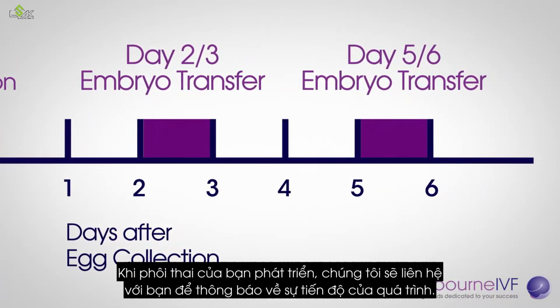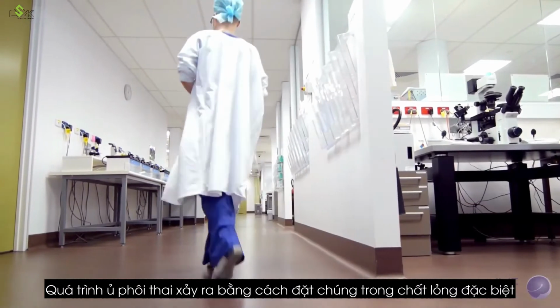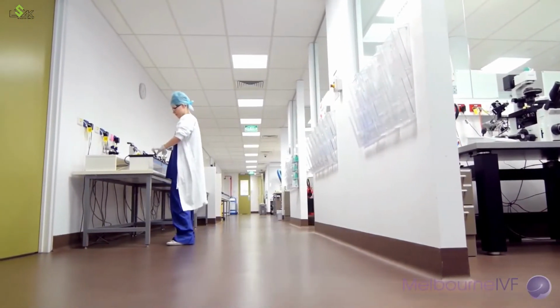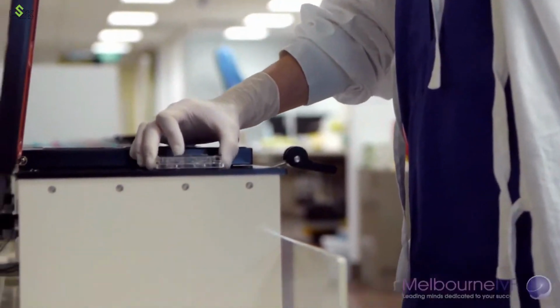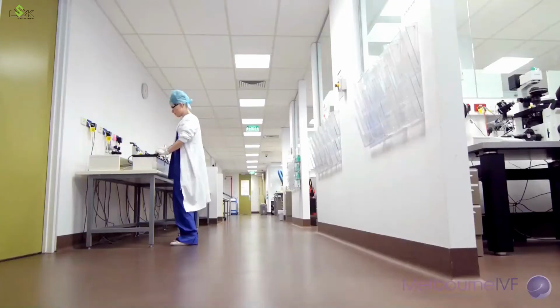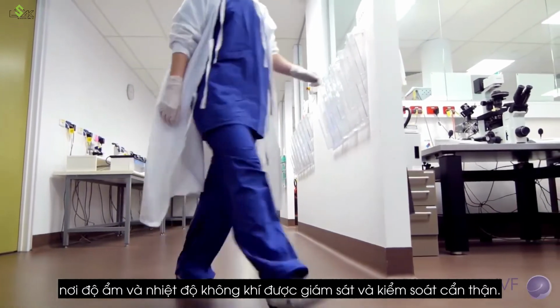As your embryos develop, we will contact you to inform you of their progress. The incubation of embryos occurs by placing them in special growth fluids called media, referred to as culturing. The embryos are then incubated and monitored for 2 to 6 days. The fertilization takes place in incubators at 37 degrees, where the atmosphere, humidity, and temperature are carefully monitored and controlled.